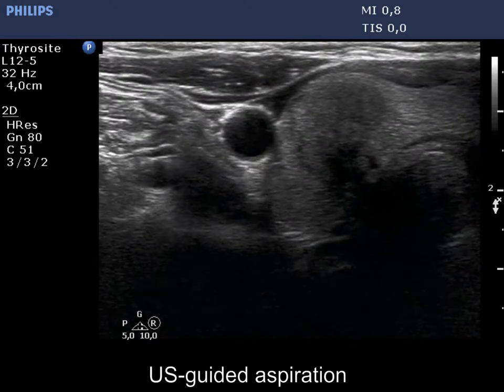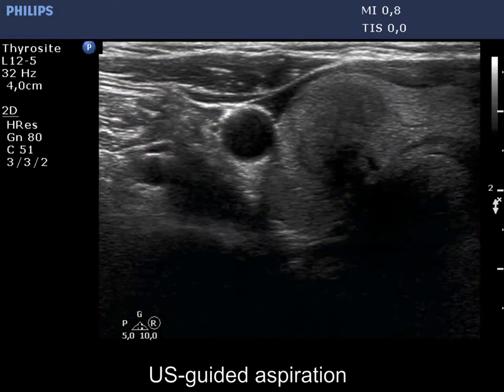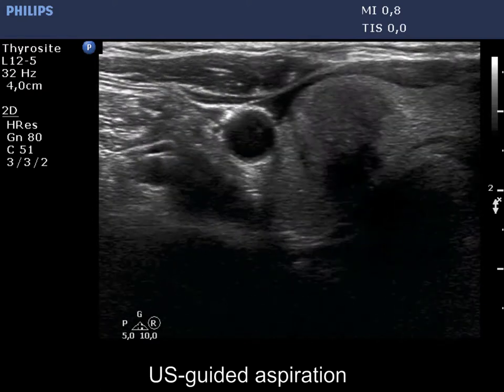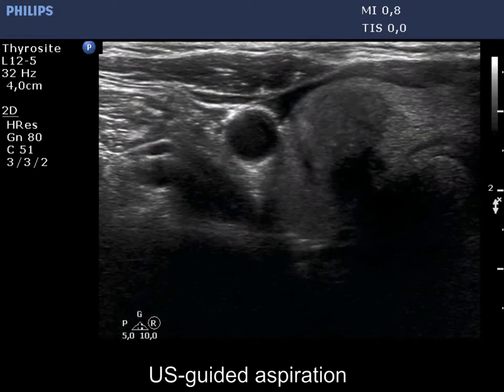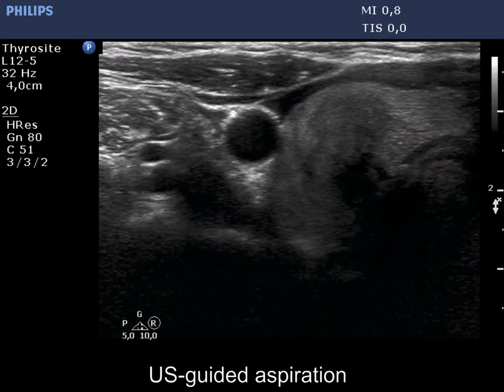Finally, a US-guided aspiration is presented. The tip of the needle is clearly seen in the lateral part of the lobe.